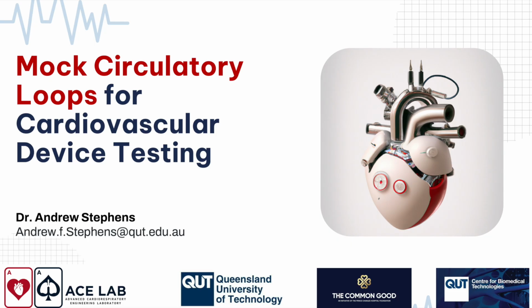This side of the system represents the body and organs, whereas this side of the system represents the lungs. And we'll walk through those as we go. But basically what we have is things coming out of the heart, going into the aorta, coming down through what is represented by the body. The body's using up the imaginary oxygen. The deoxygenated blood gets pumped through the right side, back through the lungs, is oxygenated, and returns to the left side of the heart to complete the loop.